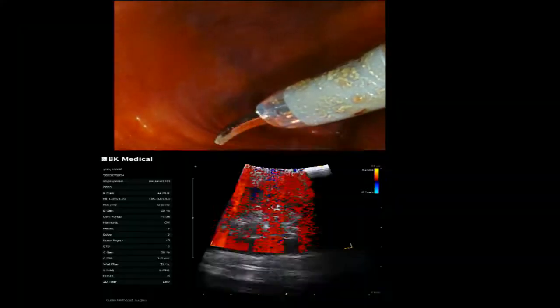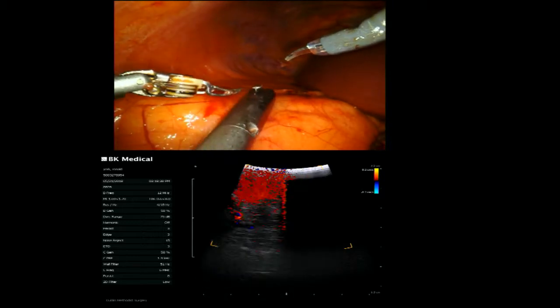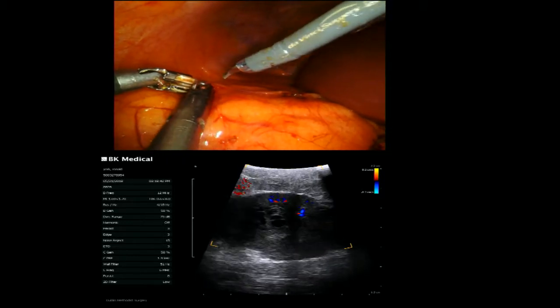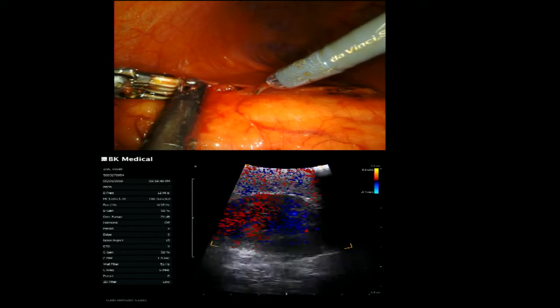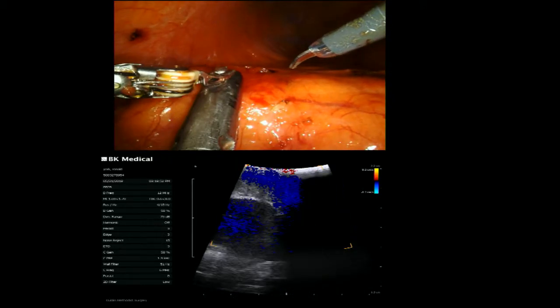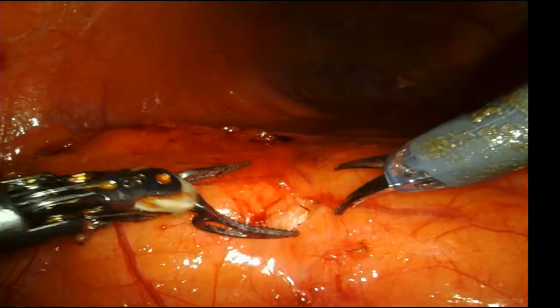All right, so actually, before I take that away, let me have that back for 1 second. So the Doppler, you can see there, helped us with figuring out the perfusion. Now I'm just gonna figure out where I wanna clean off the kidney. So it looks like the tumor comes up to here. It's going there, so we'll just kinda clean this area. And it's kind of a lateral tumor, so we're gonna probably flip the kidney a little bit towards us here to get the best possible look at it.